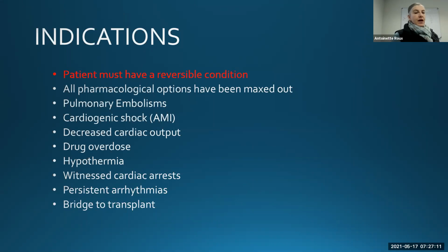the aorta. But now in hypothermia, you don't have that because the heart rate's dropping, and you go into a bradycardia and maybe your heart's slowing down too much, and then you need to put the patients on VA ECMO so that you can protect all the other organs on the other side. Then, and this is also very important in VV ECMO.